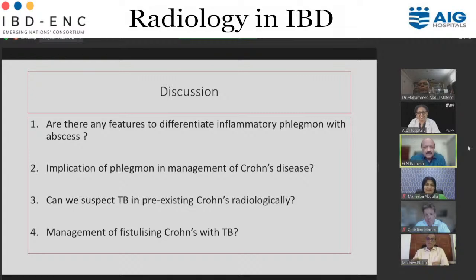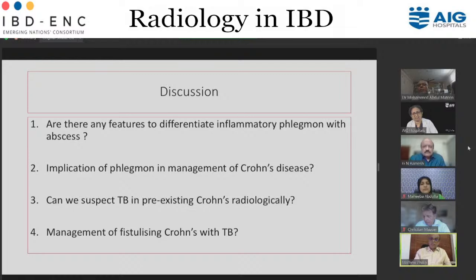Let me put it this way. All attempts must be made to rule out tuberculosis in such a situation. There's no doubt about that. Now, Dr. Rajendra told us that this patient was positive for MTB on the gene expert test. So the diagnosis is there. Was it a first presentation we are showing, or was the patient on biologics and then developed this? The patient was not on biologicals actually.